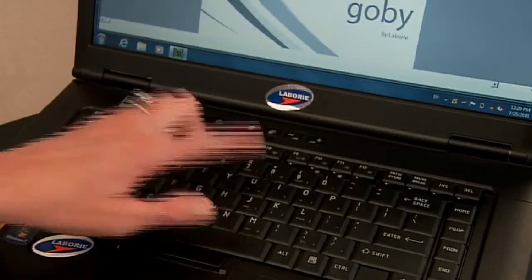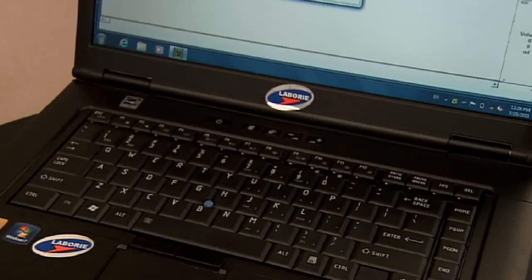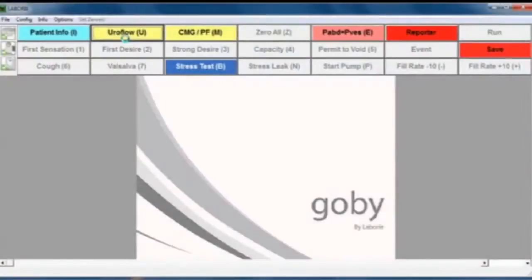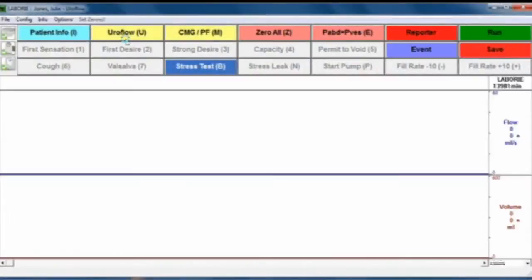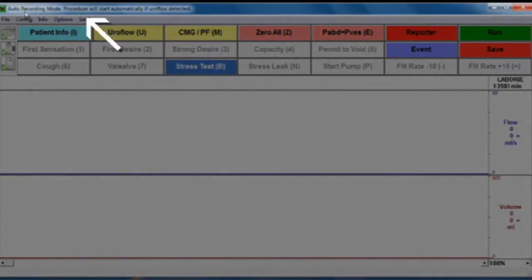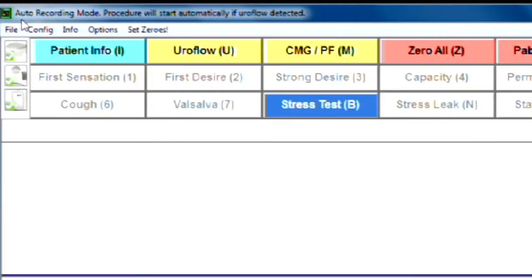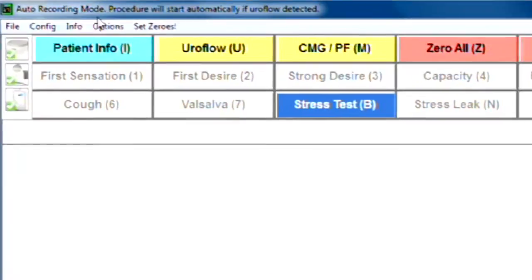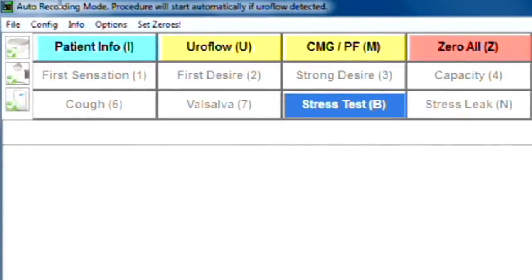You can also choose this by clicking the letter U on your keyboard. If the beaker is placed properly under the funnel, you'll see that at the top of the screen it says auto recording. The patient is then able to void at any time, and the Uroflow will be recorded from start to finish.